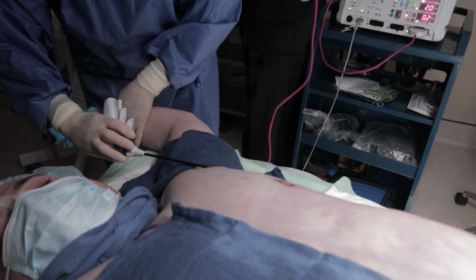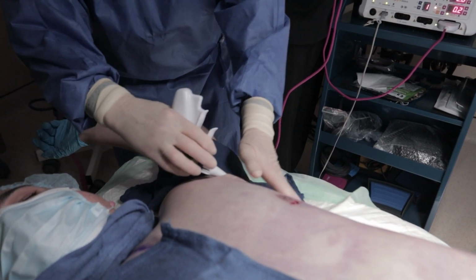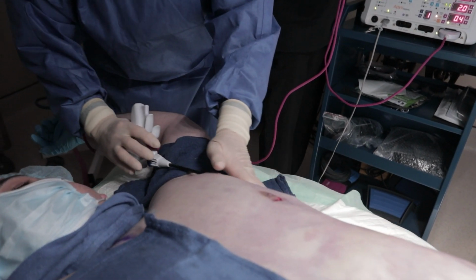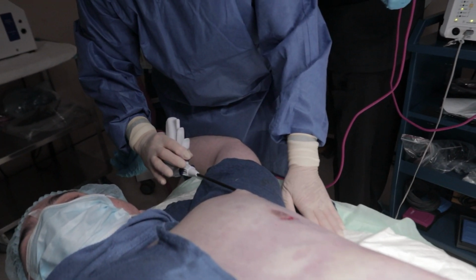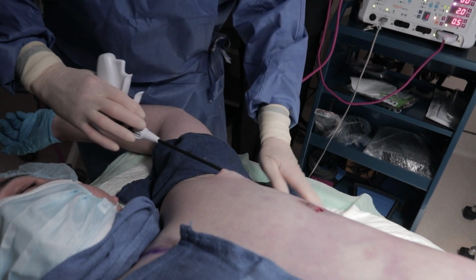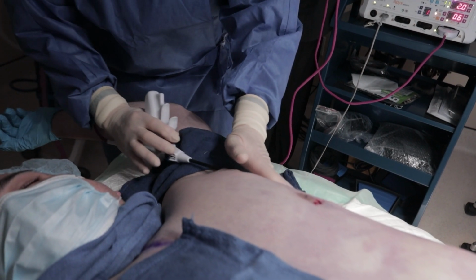So here we go on there. I think 1.5. And remember, I can always see where I am. Any instrument in the wrong hands is dangerous. In the right hands, it's perfect. And I think this is an amazing tool, produces amazing results, and I think it tightens the skin amazingly, no matter what other people say.